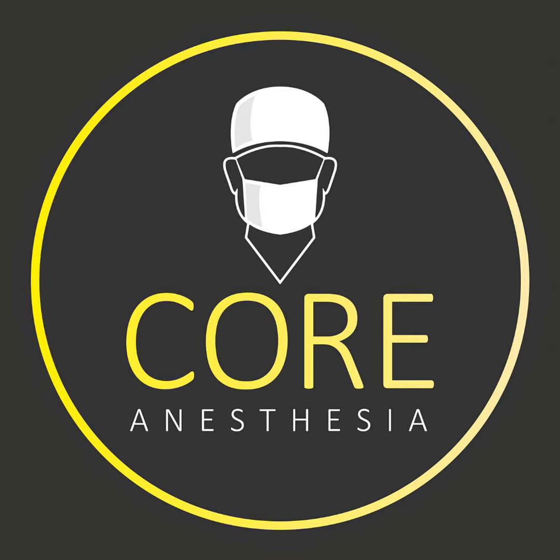But with the automated blood pressure cuff, you're going to have the cuff inflate past the point of stopping arterial blood flow. So say the person's blood pressure is really 120. It's going to go up to 140, 150 and completely stop the arterial blood flow, and then it will start to come down. The systolic number is where you start to have pulsation and blood flow again in the artery.